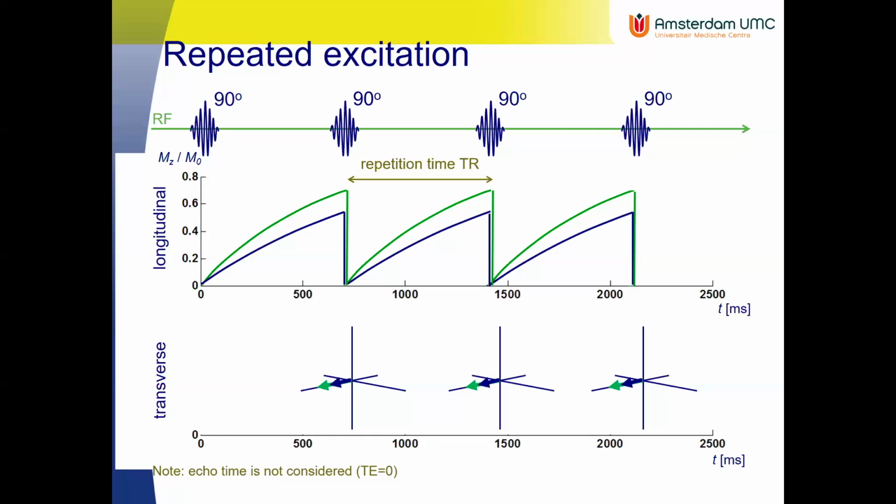So I'm sorry, I'm not understanding your question. You mean in the transverse and in the longitudinal? Yeah, well actually, they do. So the question is if the transverse and the longitudinal magnetization exist both at the same time, and if they can sort of grow at the same time. So in reality, they do both exist, and both T1 and T2 relaxation happen simultaneously, but they are sort of relatively independent processes.